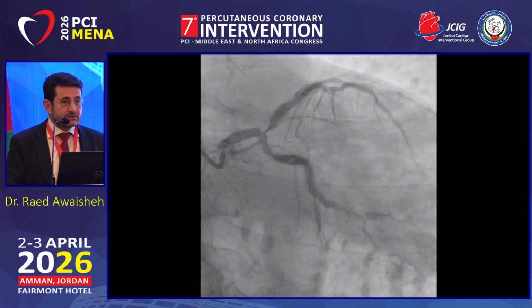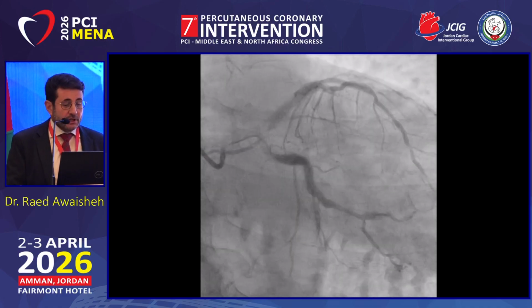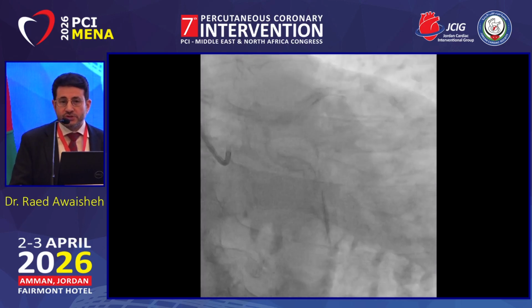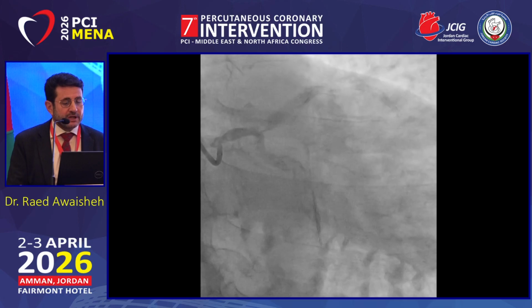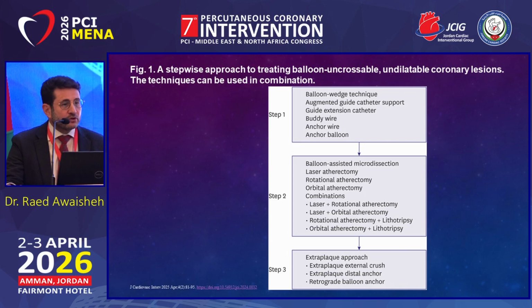So, any ideas? For the sake of time, as we are in a rush, here we use the tools or techniques we actually use in CTO. As CTO operators, what do we do for nodular calcium? Actually, you have the extraplaque approach. What do we mean by that? It is to go behind the calcium, crush that calcium, and overcome this problem.